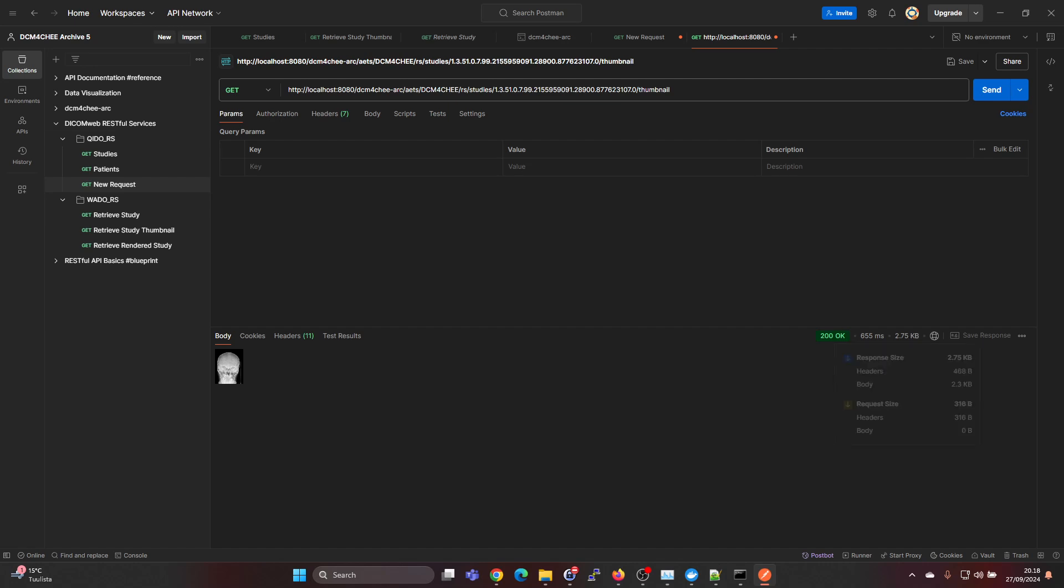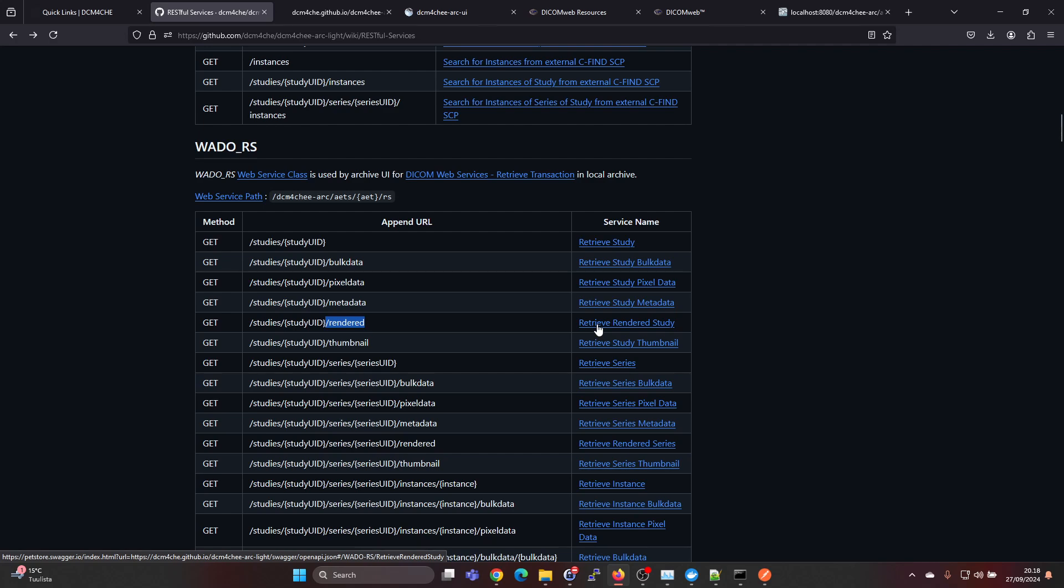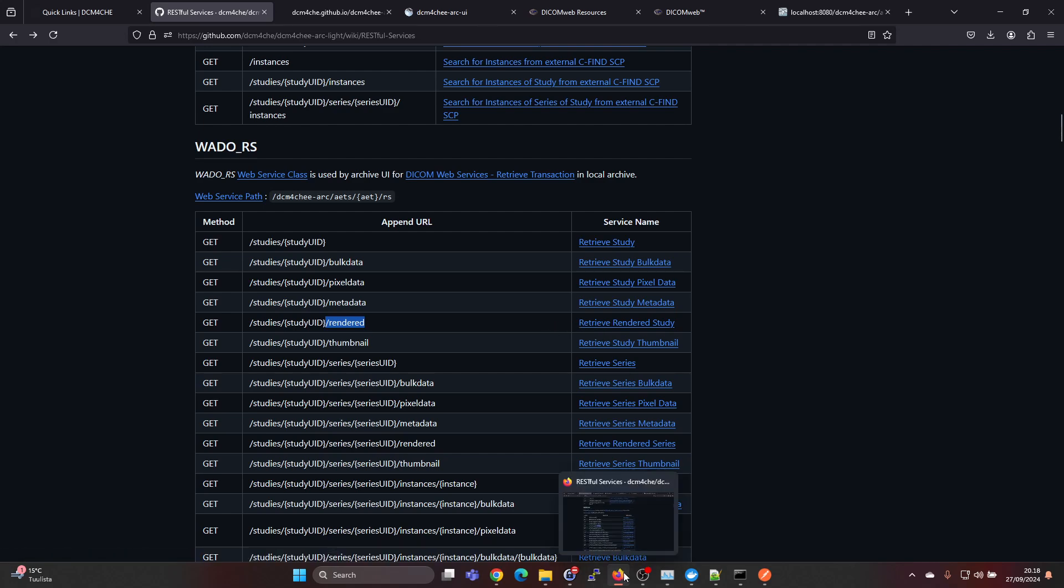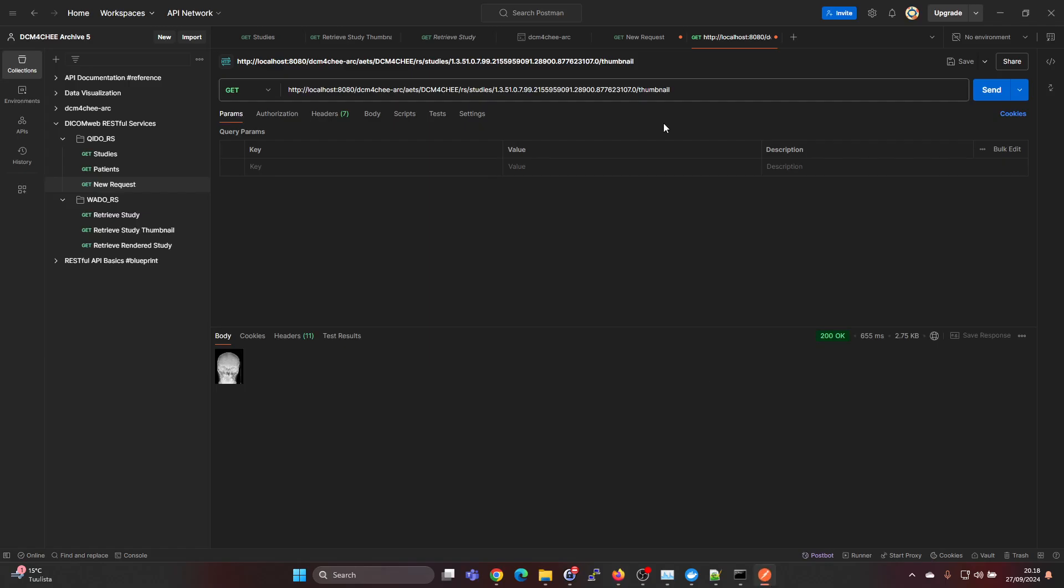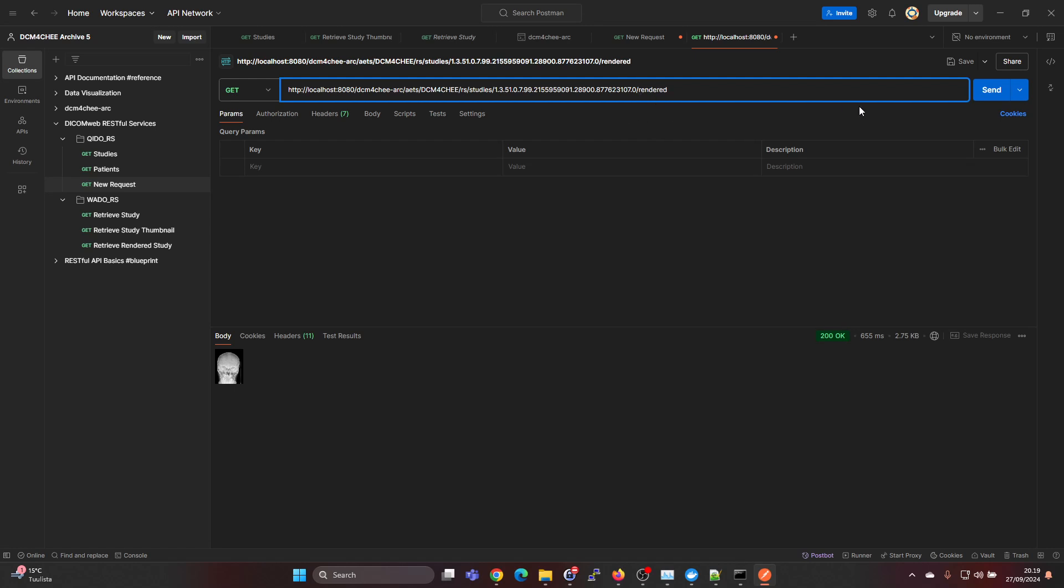There's also an option to add slash rendered and we should get a rendered study. If we go again back to Postman, we can add that. Let's take the double slash away. Rendered.